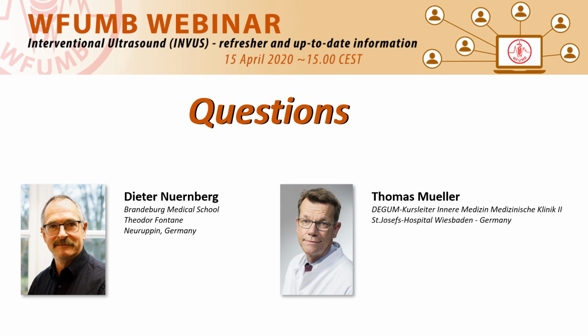The second question is, what experience does Dr. Muller have with fusion systems where ultrasound imaging is live combined with CT or MRI scan in practice, biopsies, clinical experience? I think the most important application of fusion imaging in biopsy is at the moment the prostate biopsy in men.